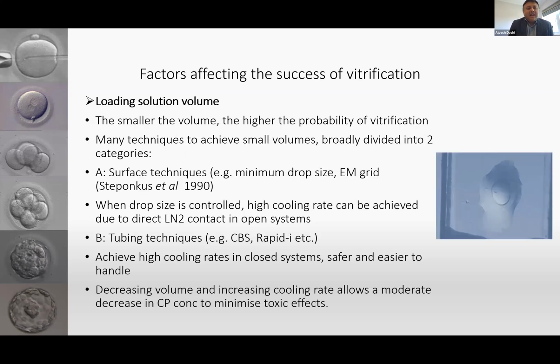And one of the main factors that I feel is quite important in determining success, and I tend to spend a lot of time on when I'm training my embryologists on vitrification, is the loading volume in which the embryo or the egg is placed on the carrier. In the picture on the right hand side, you can see that there's an egg there in a very minute amount of media. Typically, the volume that we are expecting to release the egg or the embryo in is less than 1 microliter. Now, I appreciate that we can't sit there and measure 1 microliter, and 1 microliter can be very subjective when we're doing the process. But again, practice makes perfect.